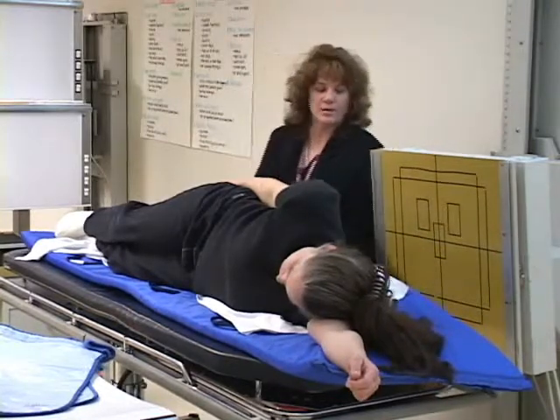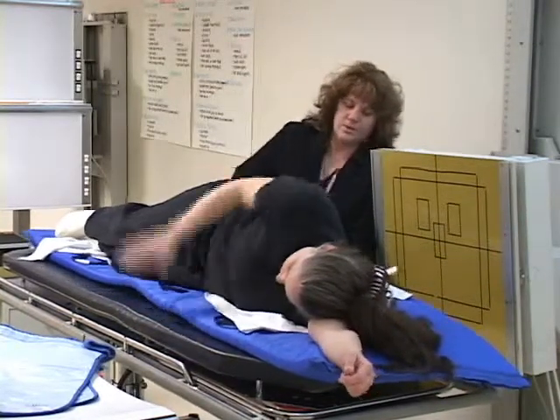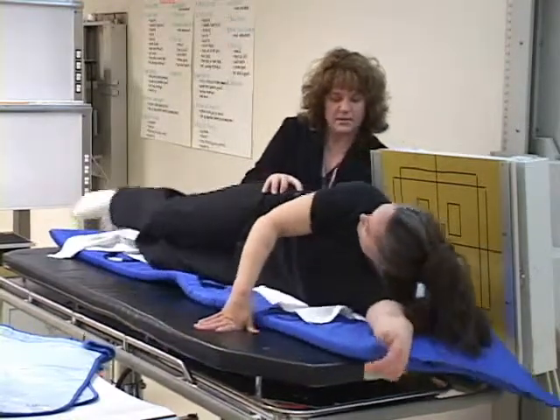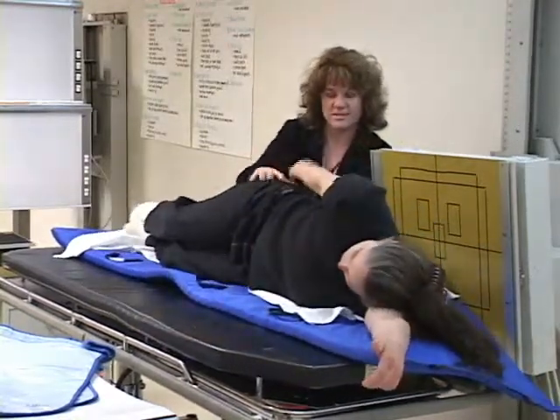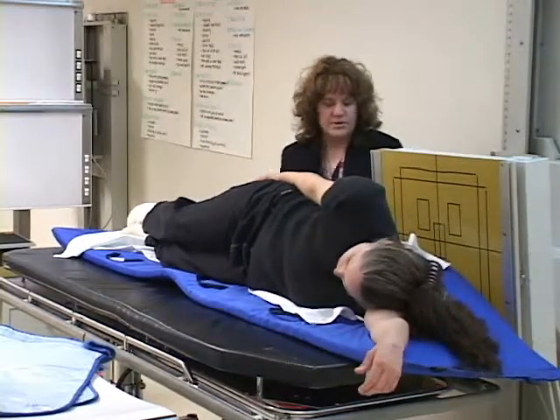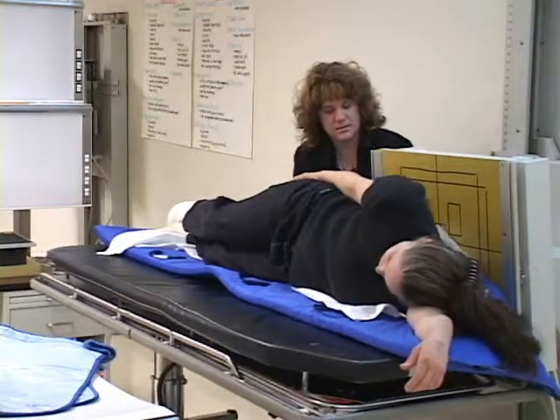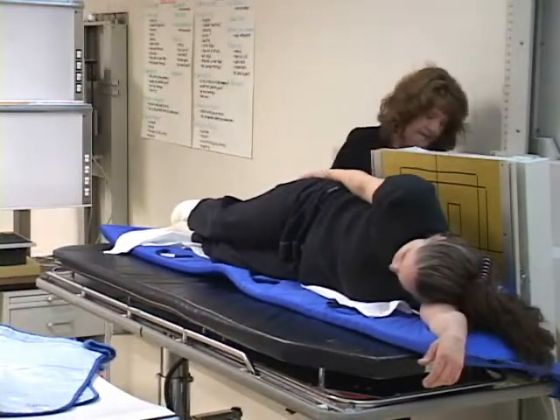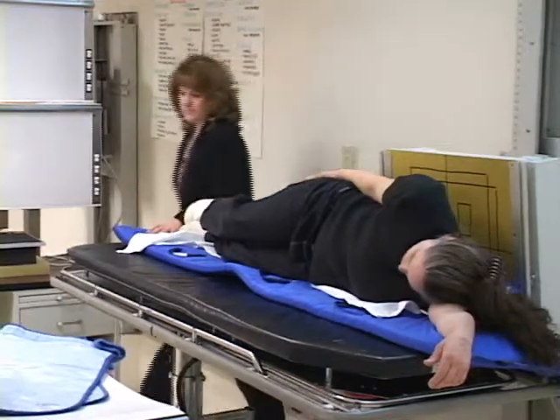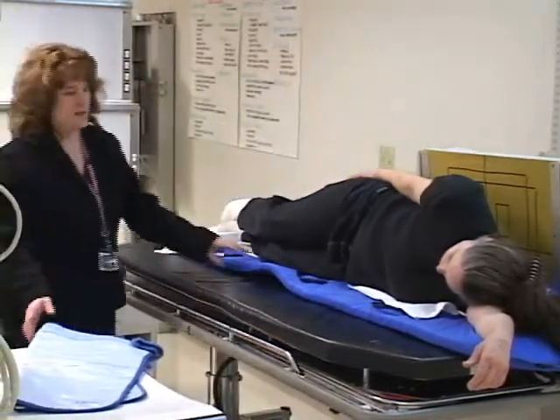Some gurneys lock better than others. I'm going to bring her back towards me as far as I can get her back there. I don't want her to fall off the edge of the table though. Okay, so I'm being very careful. I'll put her up against the wall bucky, and again I will lock my gurney. I will come back around.